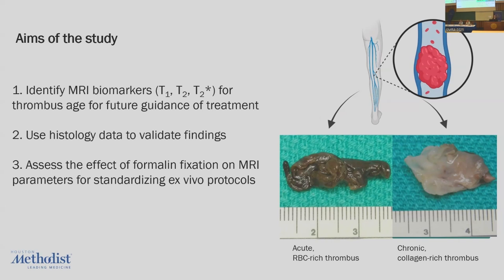And of course, we wanted to validate this data with histology findings and assess how formalin fixation affects these relaxation times for further standardizing ex vivo protocols.